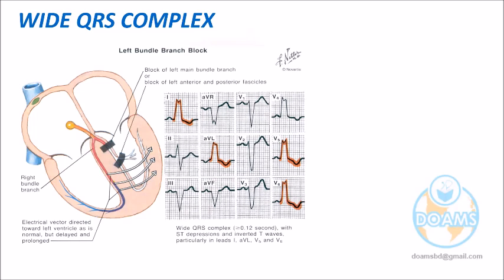This is not marked in the picture here. What is aVR? Is there any W pattern? It is in the W pattern. So this is the reciprocal change. In the left-sided leads, the QRS is fractionated by the M pattern, and the right-sided lead shows fractionation with the W pattern. So what will the block name be here? On which bundle? Left bundle branch block. But the basic thing is wide QRS should be there. Wide QRS is the basic thing of bundle branch block.